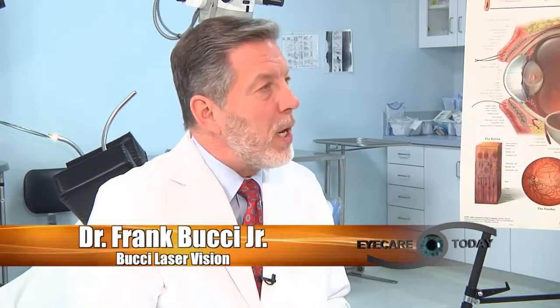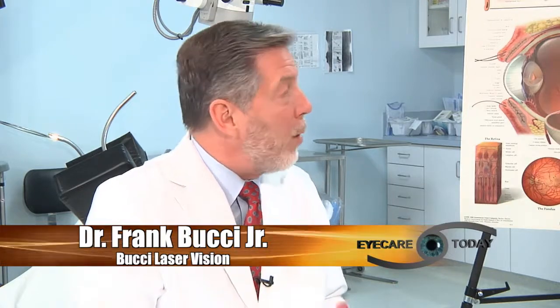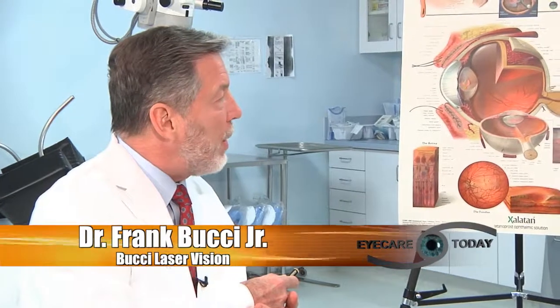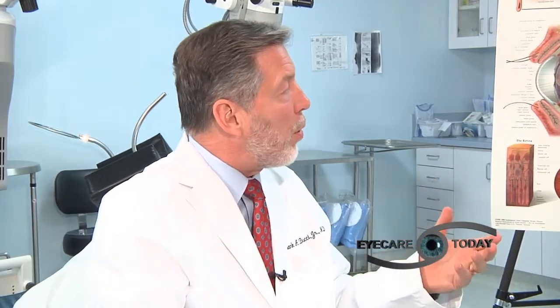So that's an amazing and intense video, and that must make you feel great to be able to do something like that. And like Drew did such a great job of really communicating what his experience was. And what's very interesting, of the lenses we talked about before that can be put into this capsular bag, he had the Distance Deluxe lens. Because of his bad eye that he made reference to, he couldn't have a multifocal lens. But he was thrilled to get excellent distance vision, really good in his good eye, but he went from 20/400 to 20/40 in his bad eye. The eyes can work together now, and so he did have that distance deluxe lens.